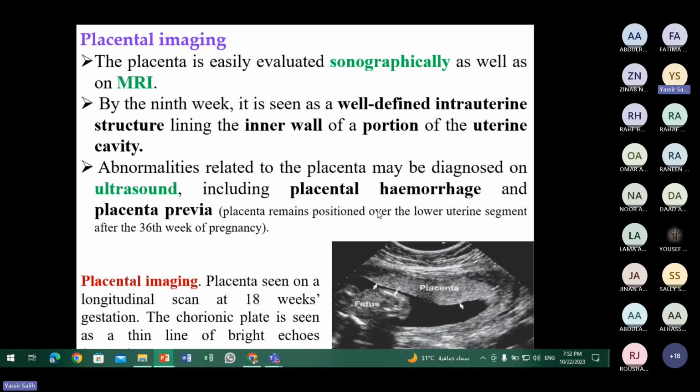طيب احنا عندنا the placenta lower edge. احنا طبعا عارفين عندنا شنو الفندس in the upper and in the lower part بيكون عندنا السيرفيس وزي the vagina. Normally in the normal person the placenta is seen in the fundus. لكن إذا كانت low down and reaching the cervix, it may cover the cervix completely or partially. So placenta previa is characterized by low-lying placenta that covers the internal os.